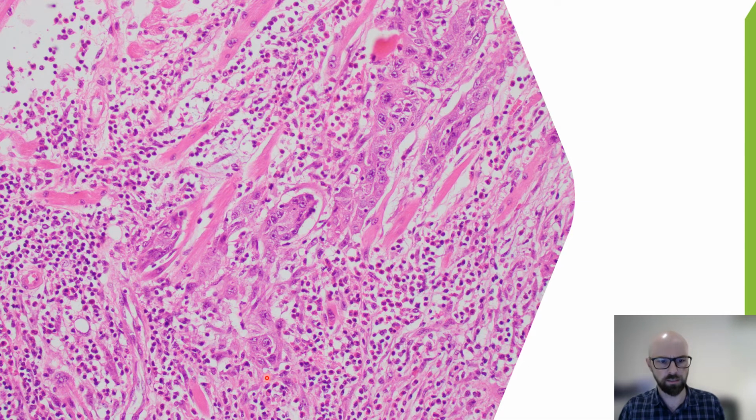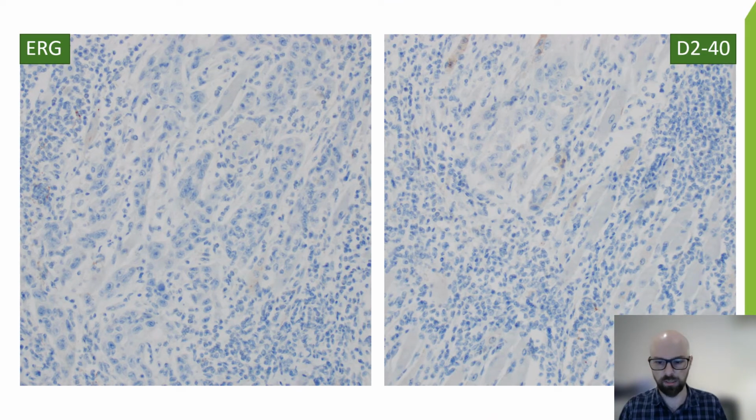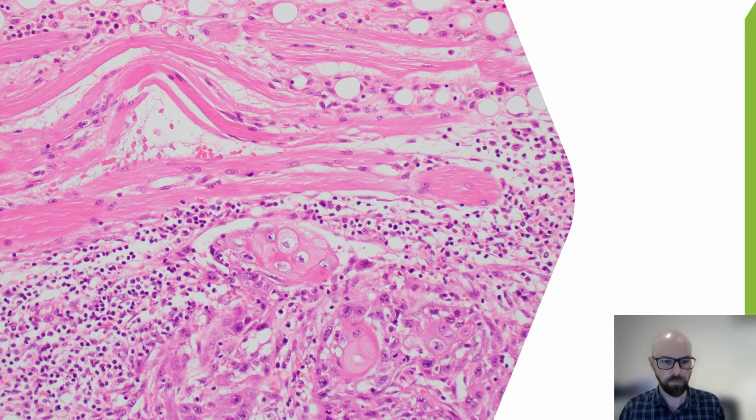This is another case where we've got a tumour nest with some clearing around it, potentially have an endothelial cell here, but it's not definite. And so immunostains help in this case, showing that no, it actually isn't lymphovascular invasion, but it is tissue retraction. And another example where we've got a tumour nest here, we've got some clearing around it. But in this case, we're not really seeing anything which looks like endothelial cells. So this is a case of tissue retraction, which may be mistaken for lymphovascular invasion.